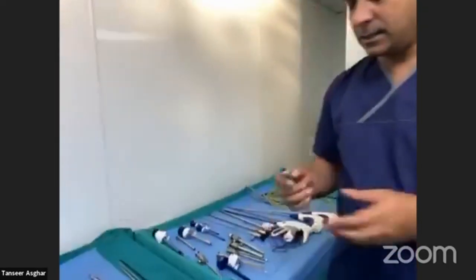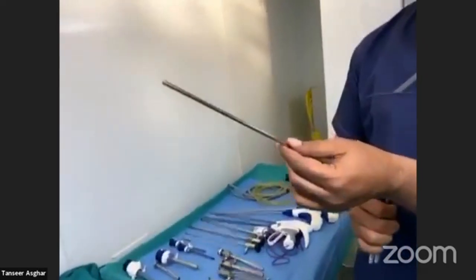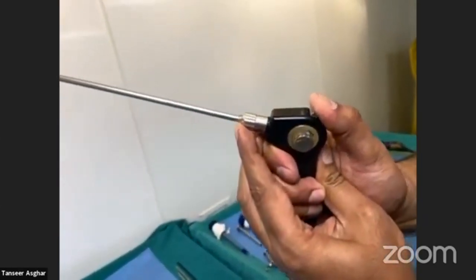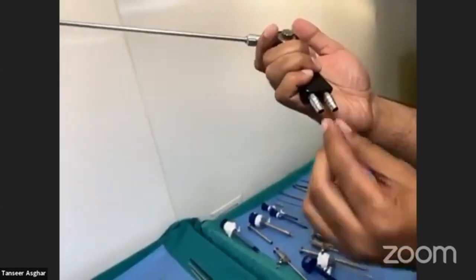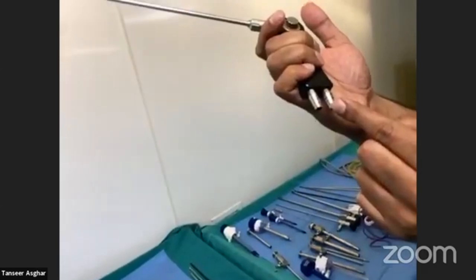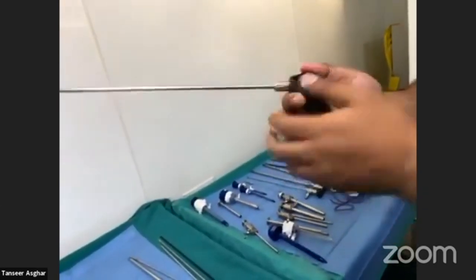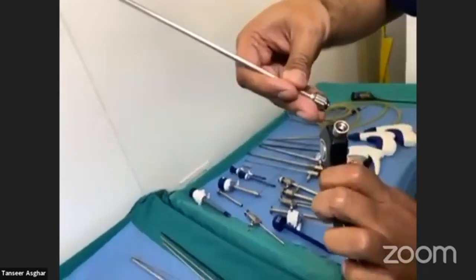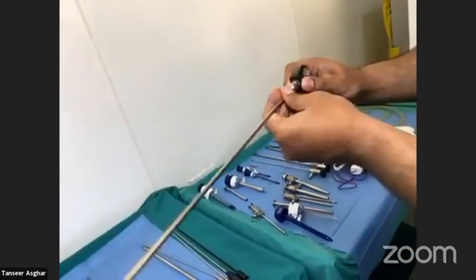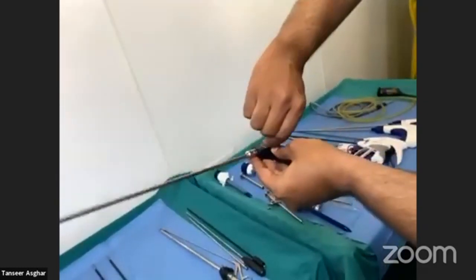Another very important instrument is the suction and irrigation device. This is a 5 mm suction-irrigation system. It has a shaft and handle, with a knob: push up for suction, push down for irrigation. You attach two pipes — one to the suction and one to the irrigation. If stones or debris get stuck, there is a knob you can unlock to flush from here. As a surgeon, you should know how to operate it better than the technician, so you can instruct your team appropriately.